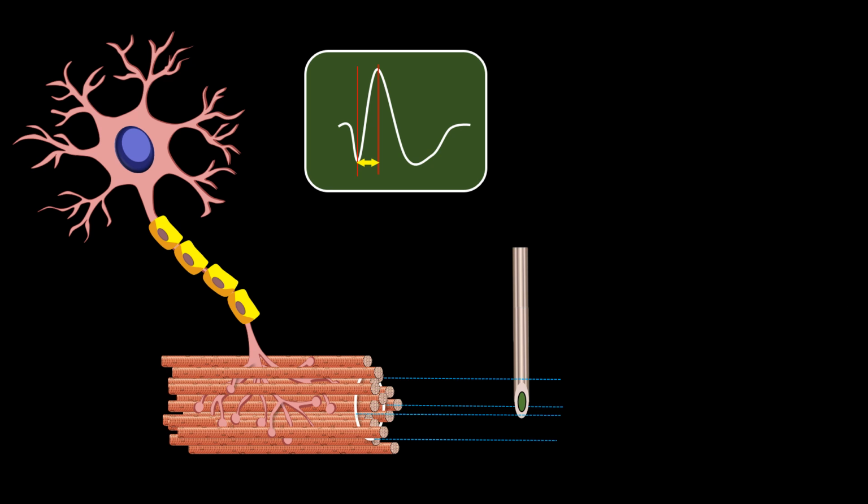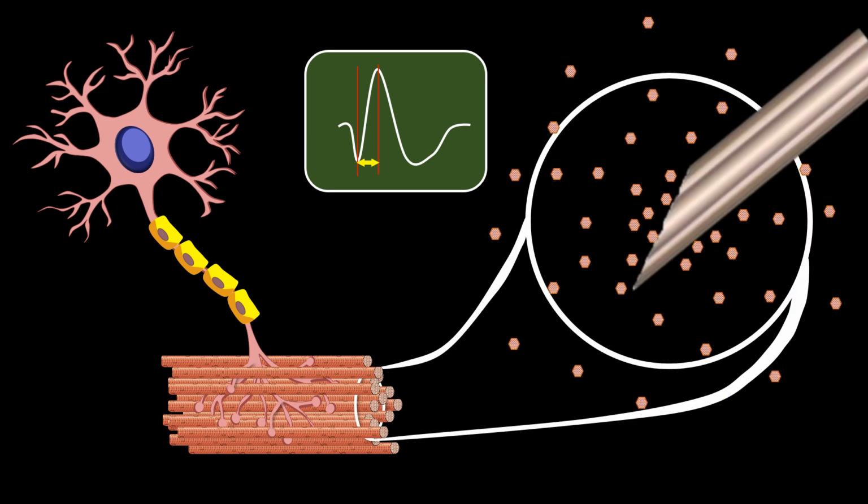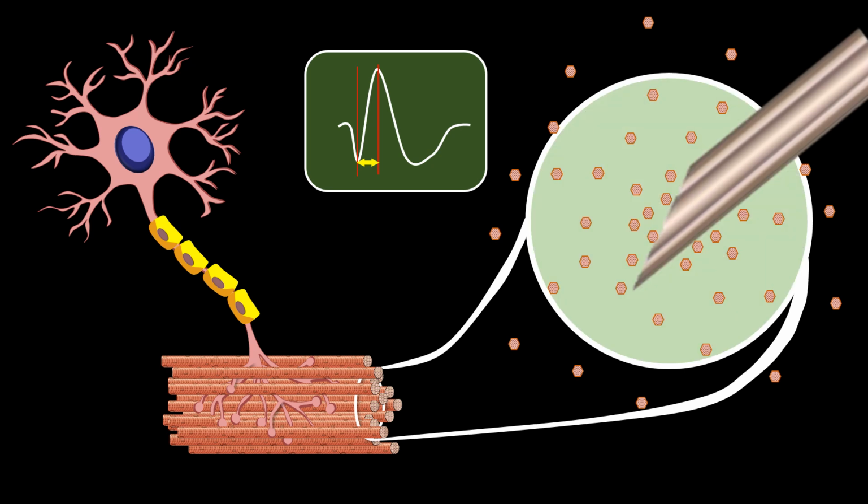Here, I have projected the area of the circle by the broken lines and now added an eye to indicate the angle of vision. Now imagine that you are looking at the specimen from the perspective of the eye. Such perspective will produce an image as the one just added. This image shows the transverse surface of muscle fibers belonging to the activated motor unit. The muscle fibers occupying the light green area, corresponding to a 5 mm diameter circle centered on the recording surface of the electrode, determine the duration of the potential.